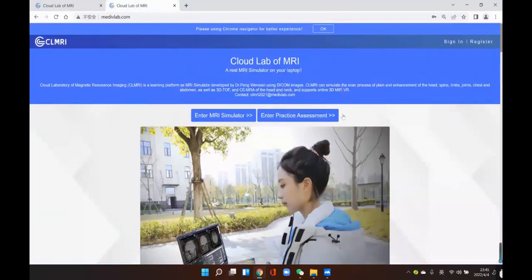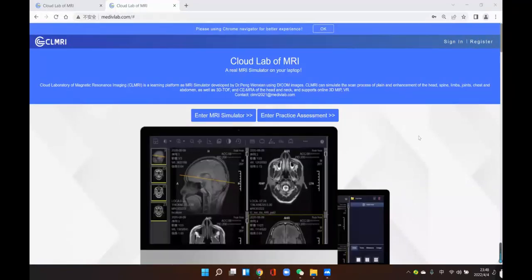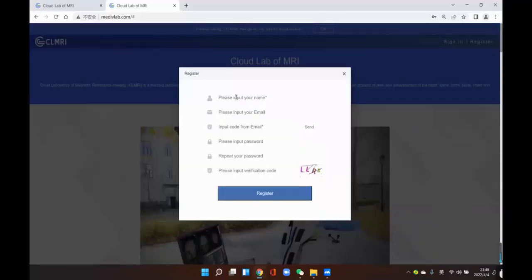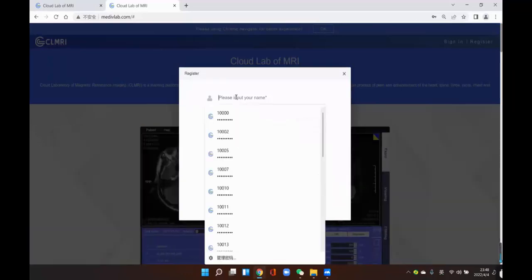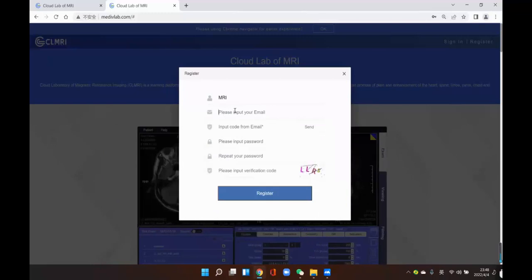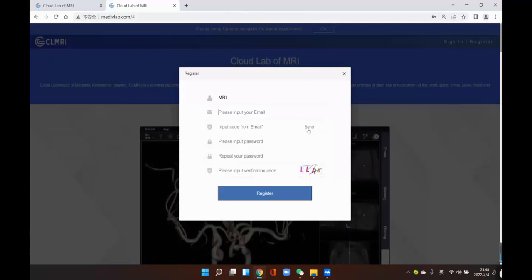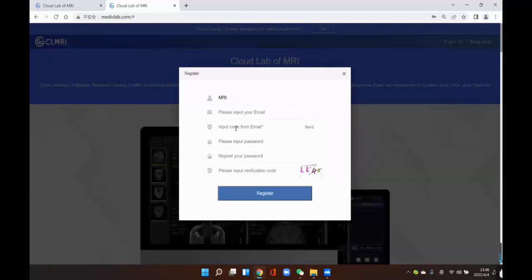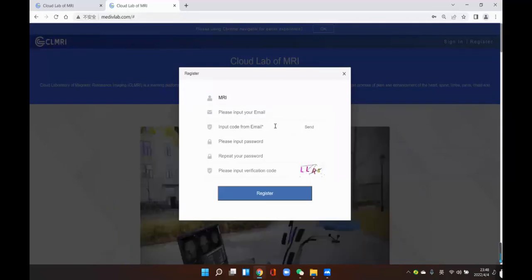At the homepage, you can see the sign in and the register button. If you have no account in this software, you can click the register button. Some information should be input as a first time: input your name, input your email address, and then click send. The verification code will be sent to your email address — you should check your email box.